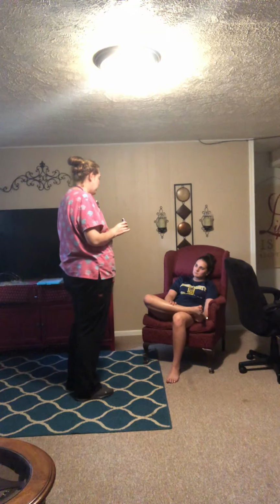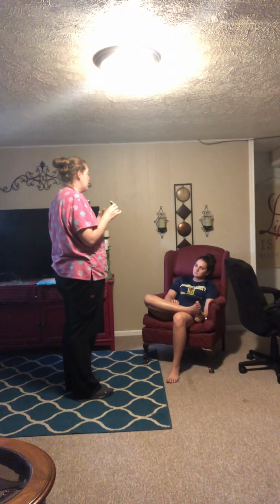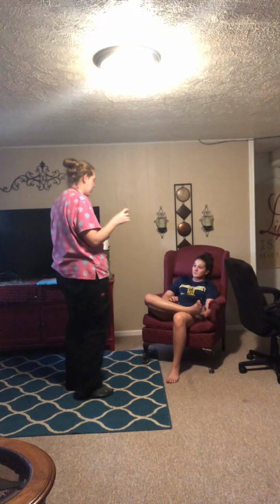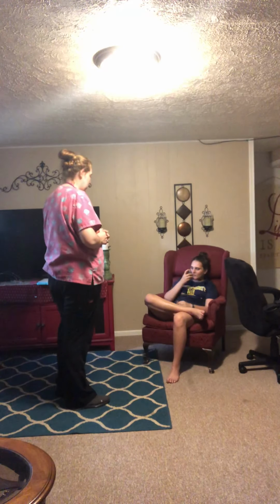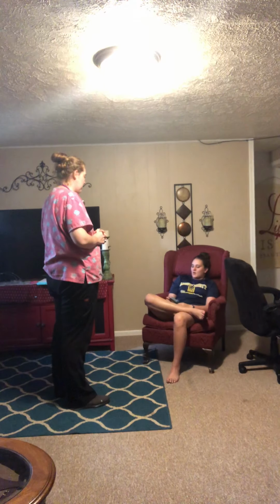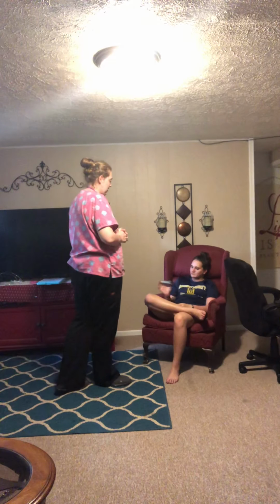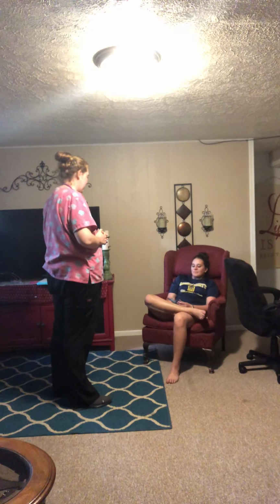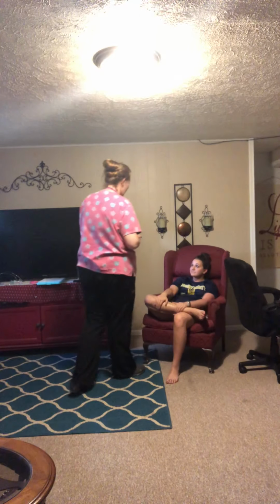Now on the Symbicort, we're taking 2 puffs, so we need to go ahead and take 1 puff, wait about 30 seconds and then repeat the process to take the second puff, okay? Okay, so we'll go ahead and do that now. Just wait a little bit, go ahead and shake it again. There you go, perfect. All right, very good. Can I have you take a deep breath in and cough for me?